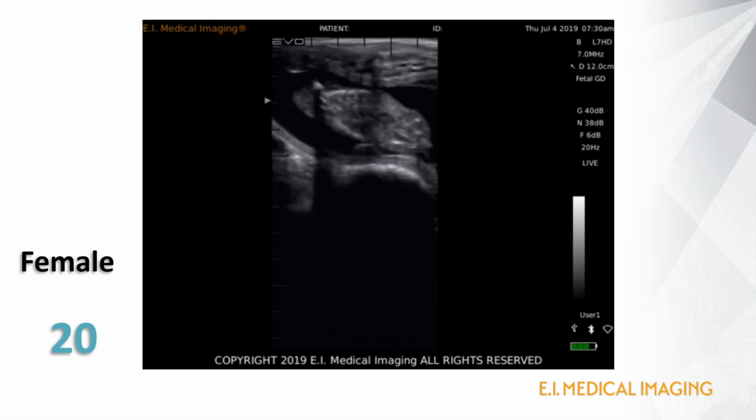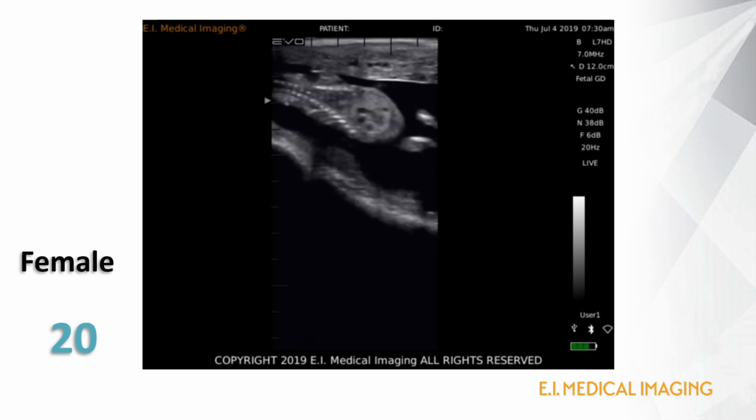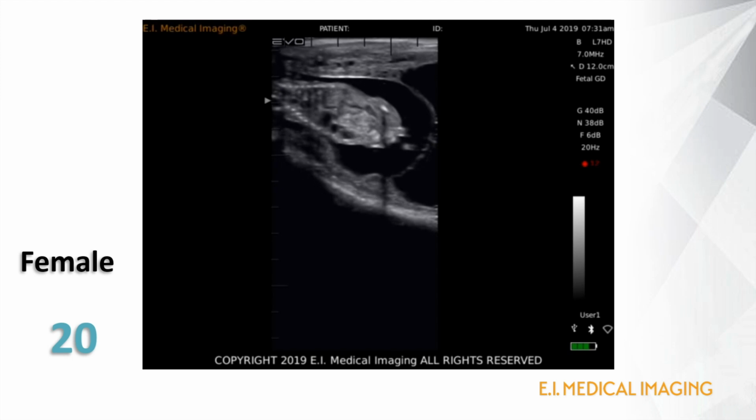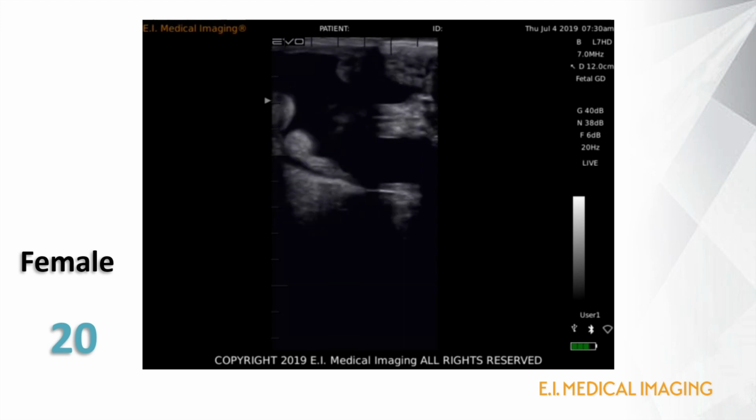You can probably tell by now that this is a really ideal gestational age and fetal position. As we move back to the tail end, we identify the female GT in the cleavage of the hindquarters. This is a heifer calf.